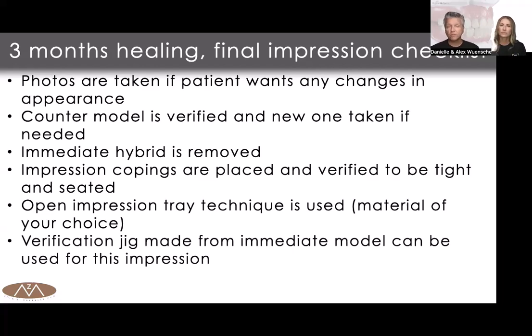As an alternative, we can also make a verification jig from the immediate model from day of surgery and utilize that by segmenting it, reconnecting it, and taking the impression on that impression day 3 months after as a master cast impression. Remember, we're going through an analog process. Remember too, I said we don't have to do an analog process. All these steps can be digital, so you can just take an intraoral scan with scan bodies, that's totally sufficient.